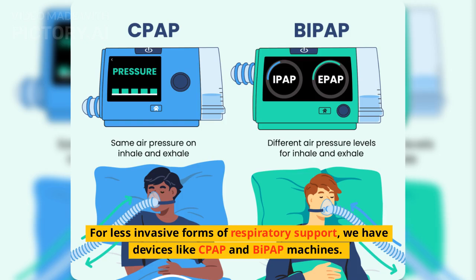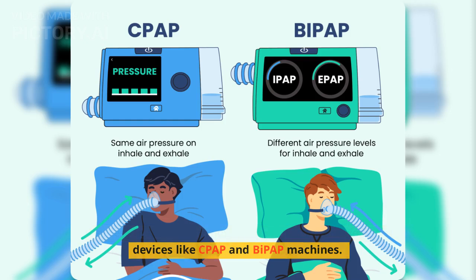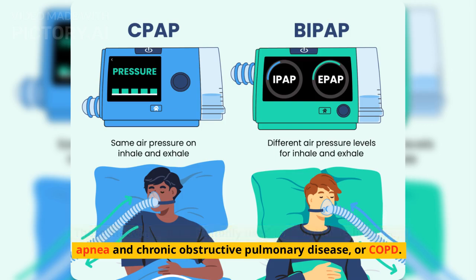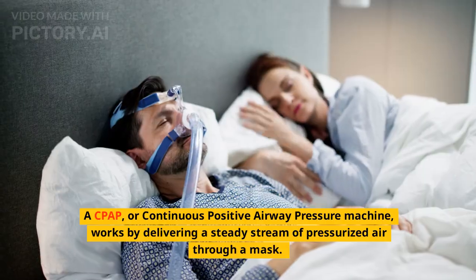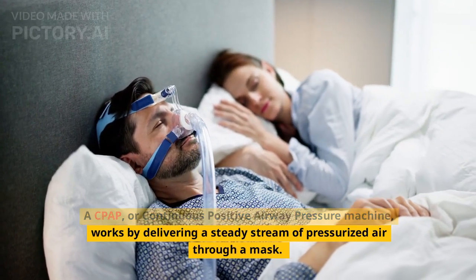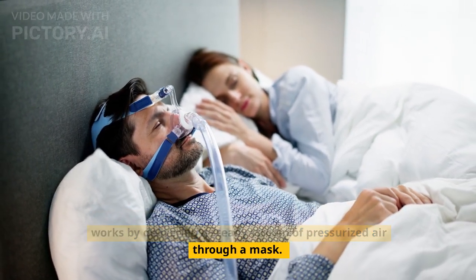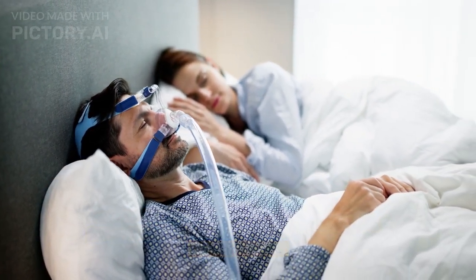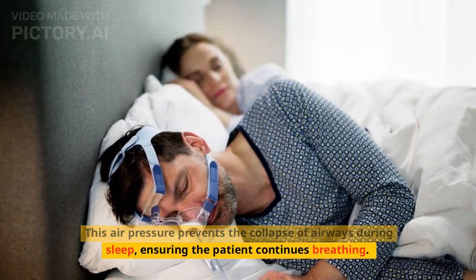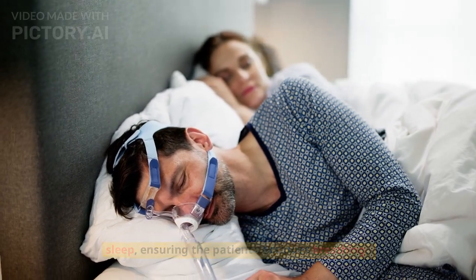For less invasive forms of respiratory support, we have devices like CPAP and BiPAP machines. These machines are commonly used for conditions like sleep apnea and chronic obstructive pulmonary disease, or COPD. A CPAP, or continuous positive airway pressure machine, works by delivering a steady stream of pressurized air through a mask. This air pressure prevents the collapse of airways during sleep, ensuring the patient continues breathing.